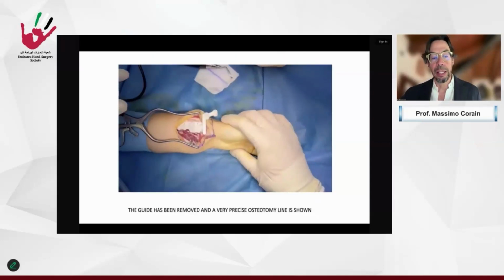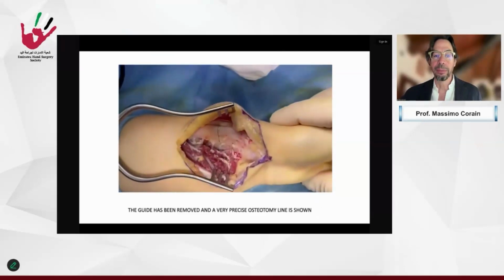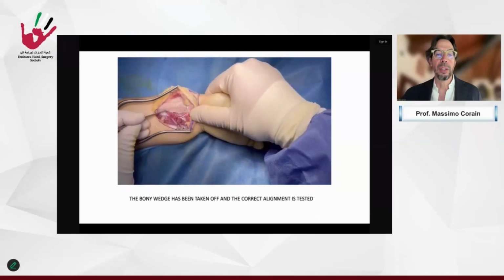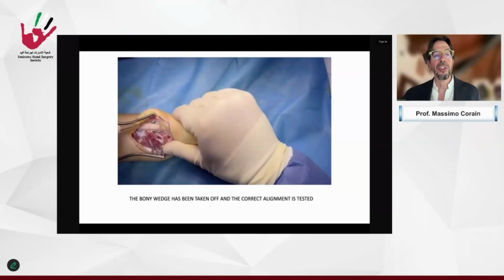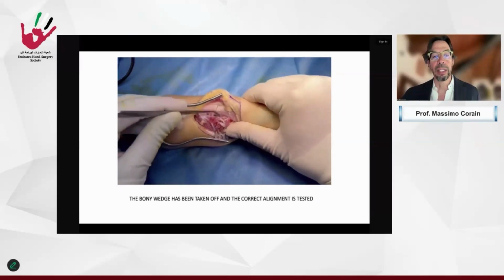Then the guide has to be removed and I check the osteotomy, and I can take off the wedge that I've signed in this way. So, having removed the wedge, I can reduce the osteotomy as planned and check how correct the alignment is during the manual testing.